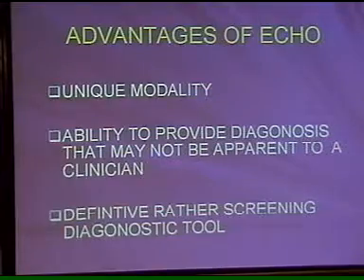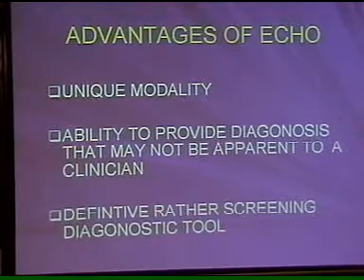Just talking about the echo at rest, just a little bit, and then going on to a head-to-head comparison with the previously described modalities. It's a unique modality, with the ability to provide a diagnosis that may not be apparent to a clinician. And thirdly, it is definitive rather than a screening diagnostic tool. So you should be very clear-headed when you are prescribing echo about what your aims are, because it definitely has an advantage over other modalities. It is going to give you a definite diagnostic clue.